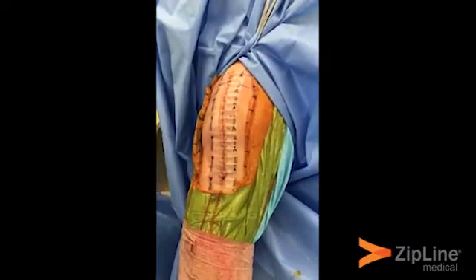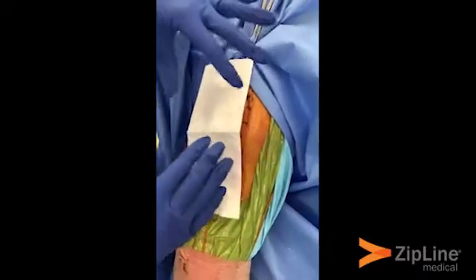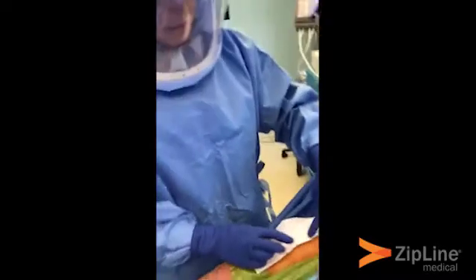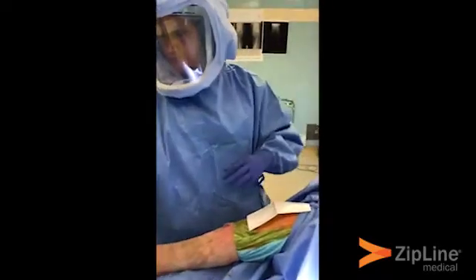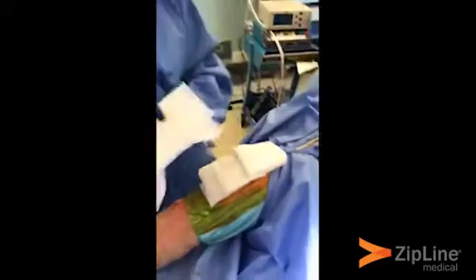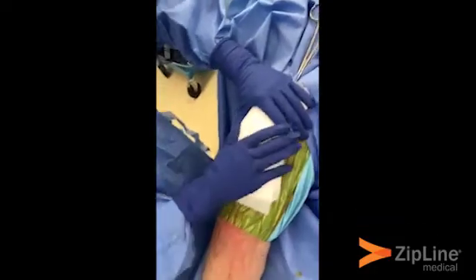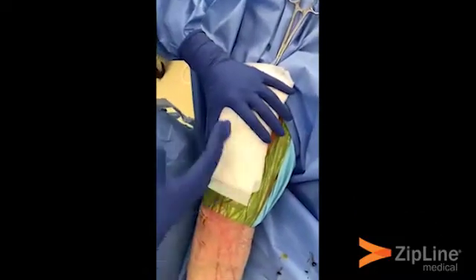That's it. Then we apply a piece of Telfa over the Zipline — it just protects it from the gauze getting stuck on the Zipline. Then you can put your gauze and any other dressing materials that you prefer over the incision, and that's it.